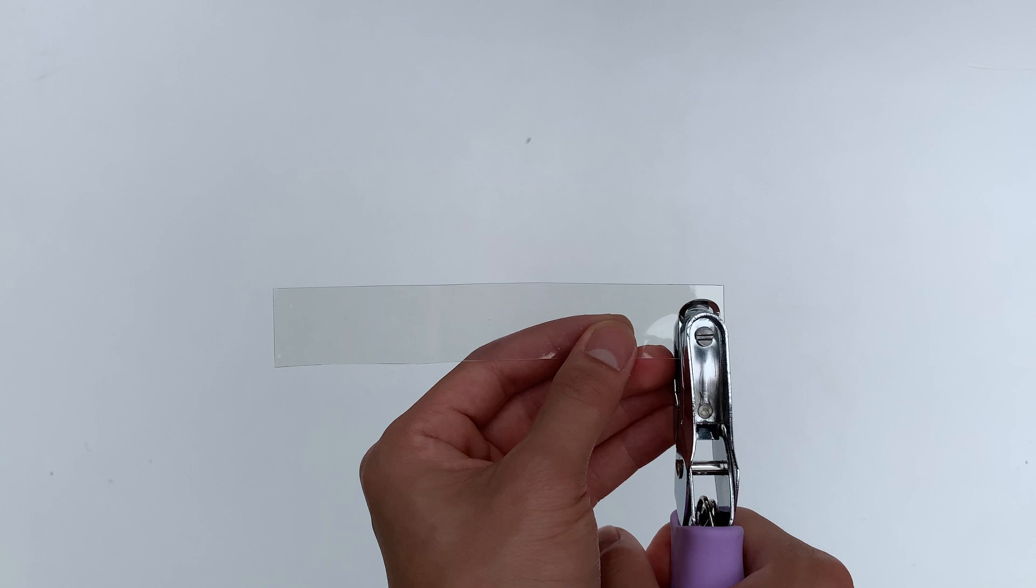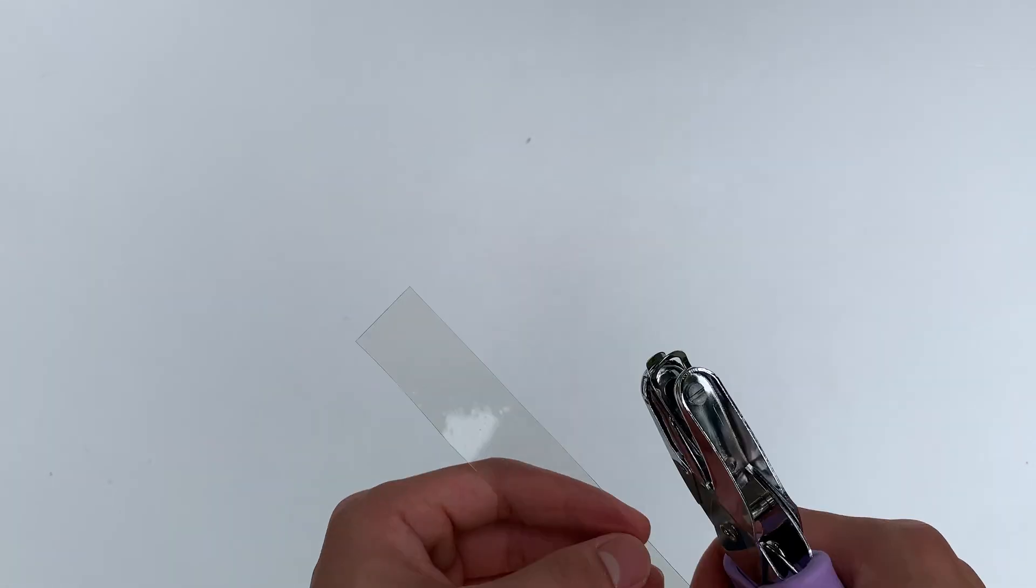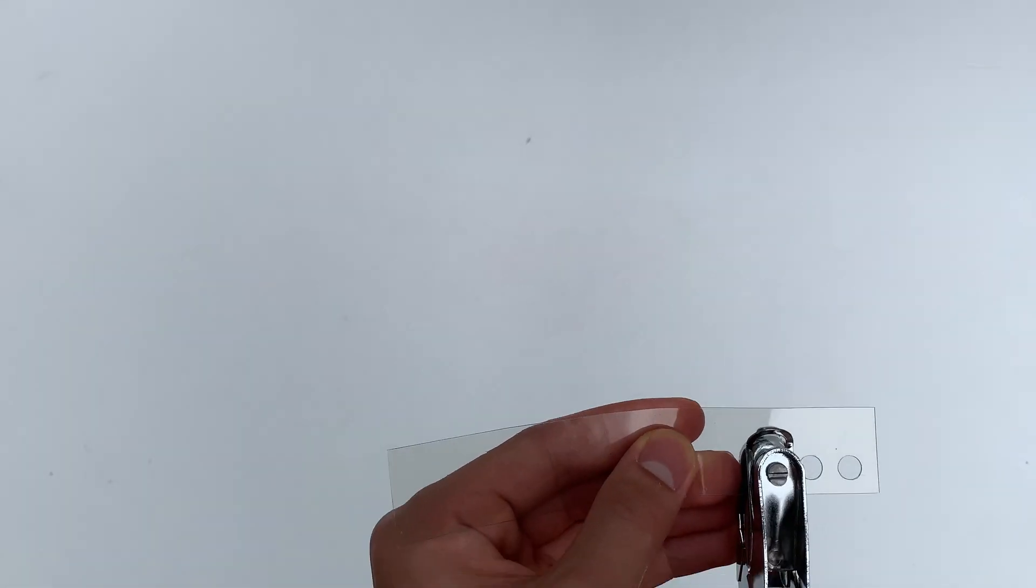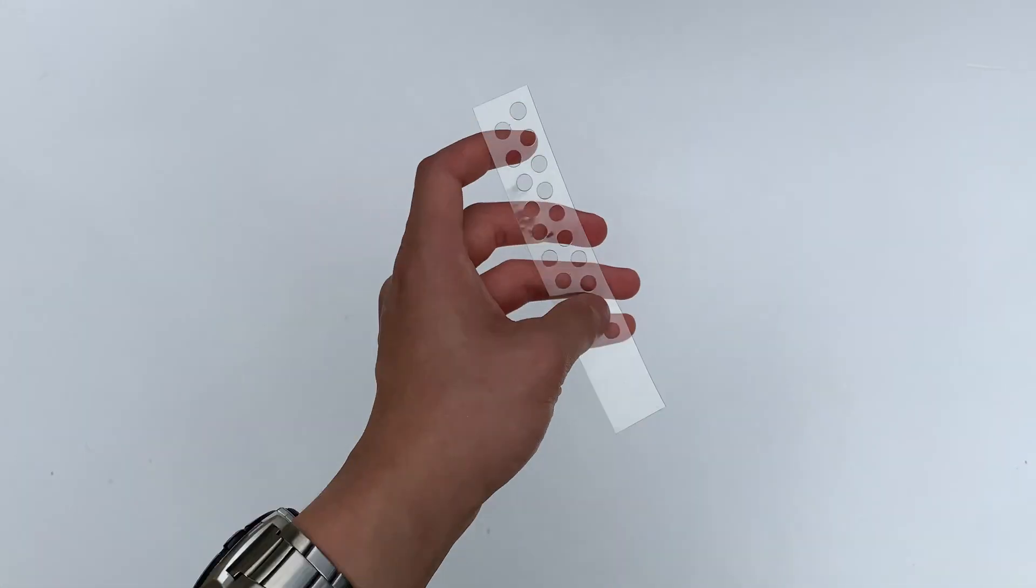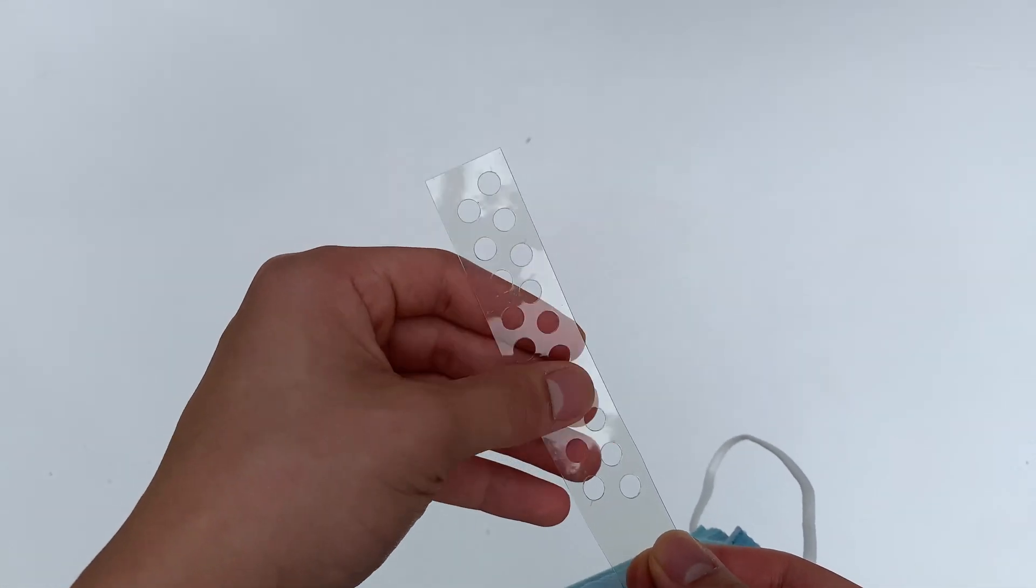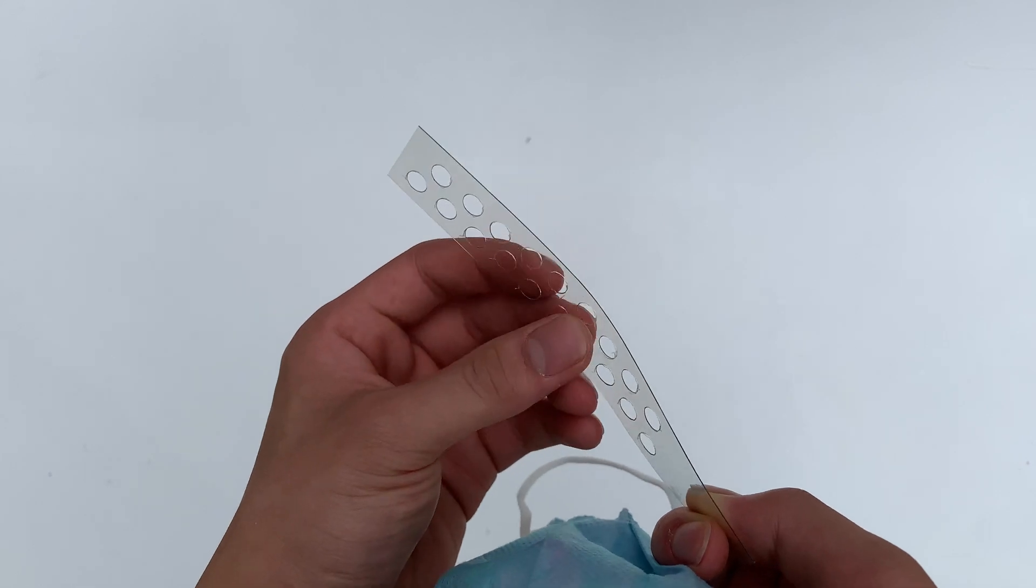You want to make sure to punch holes on the same side of the mask. Hole punches will make one side of the hole rough and the other side smooth. This way, one entire side of the plastic strip will be smooth and comfortable when you wear the mask.